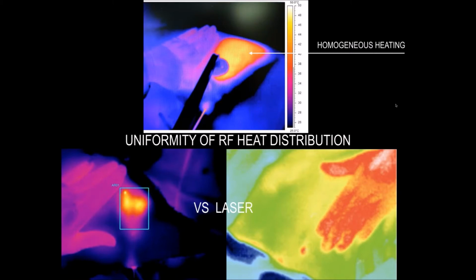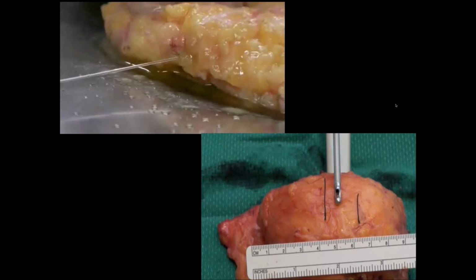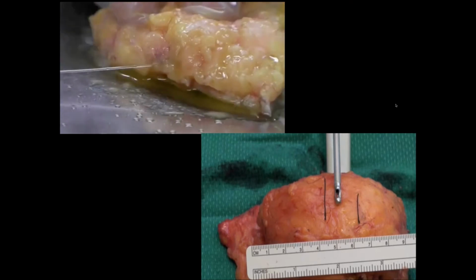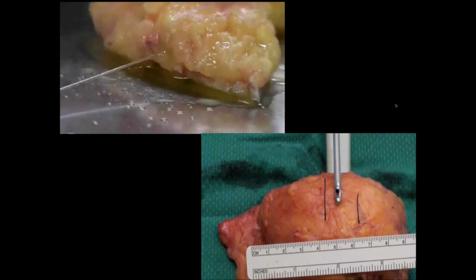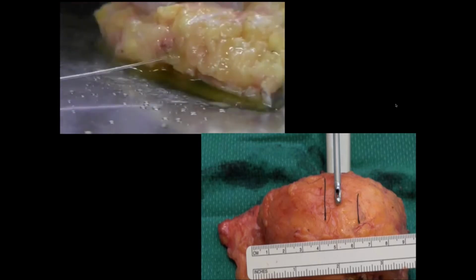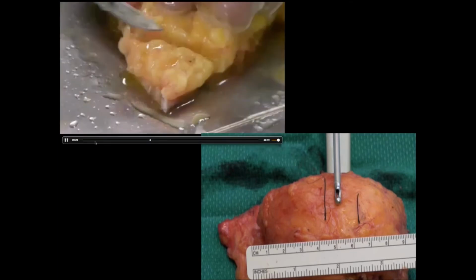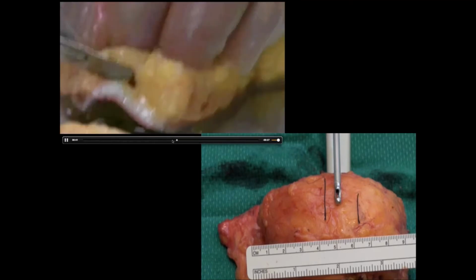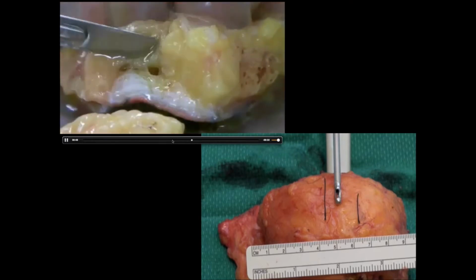So can you see now what I'm doing? This is a very old video. I have a fiber. This is 12 years old, maybe 15, I don't remember exactly. But I'm using the fiber in the fat. I am in the subcutaneous fat and maybe subdermally. But you can see only oil. I'm melting fat, because oil is growing on the table. And you can see that I made just a little hole. I go faster. Wait, okay. And look at the hole where I worked. So maybe here we can destroy the septa, and sometimes you don't have a great tightening.